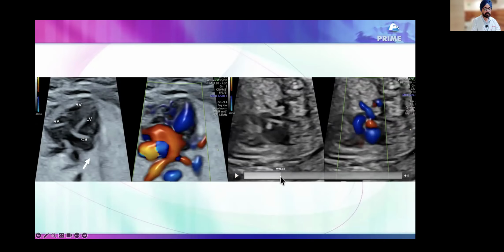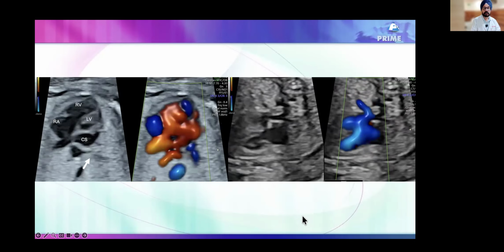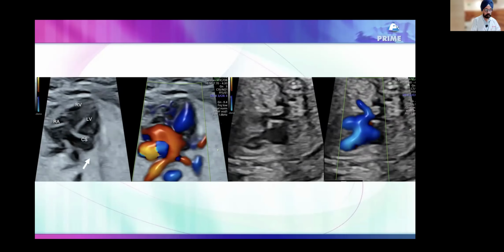See the coronary sinus and the pulmonary vein opening into it. And this needs a lot of struggle. But if you see a dilated coronary sinus and you do not see left SVC, and you have a strong suspicion of TAPVC, twig sign, then it's coronary sinus, even if you are unable to document the pulmonary vein entering into it.